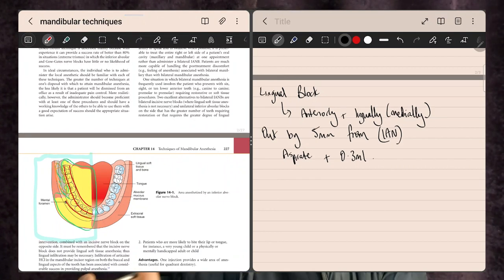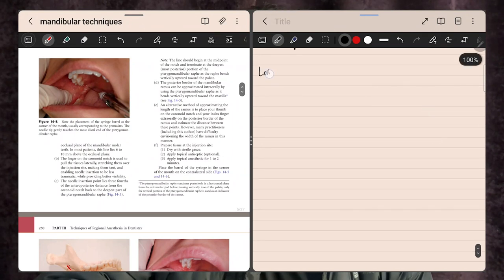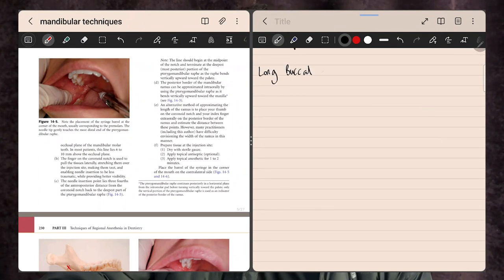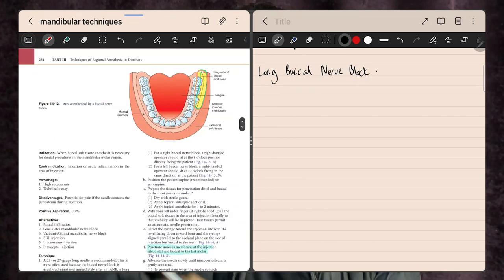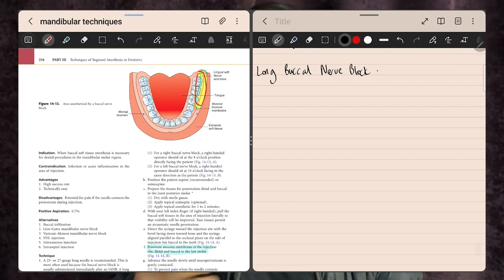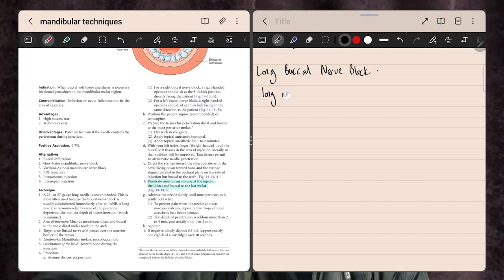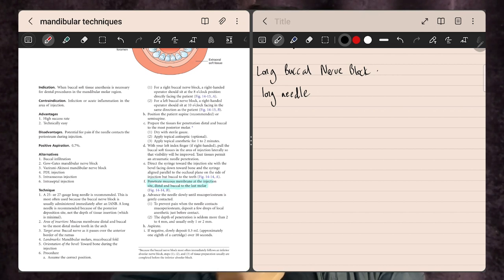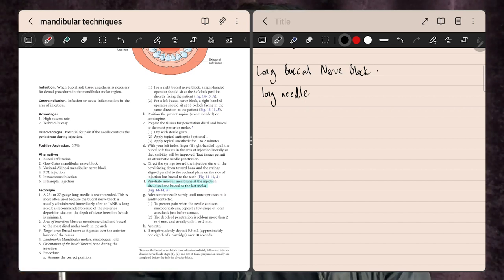The only outstanding area now is the buccal muco-periosteum in the molar region, which we can address right now with the long buccal nerve block. This is quite far back — all the way posterior or distal to the lower third molar, or whichever the last lower molar is in your patient — and buccal to that point.